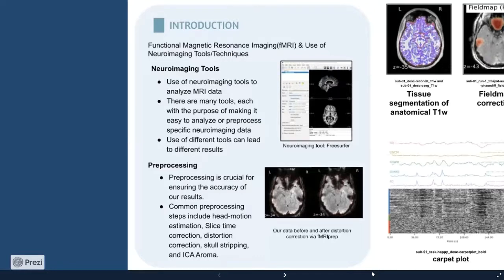When neurons in the brain respond to a stimulus or task, they require oxygen from blood. Changes in MR signals result from blood oxygen levels heightening when there's an increase in brain activity, as opposed to a resting state. BOLD signals provide the basis for fMRI and allow researchers to compare resting and stimulated states of the brain. We have started pre-processing and analyzing data from an fMRI dataset.